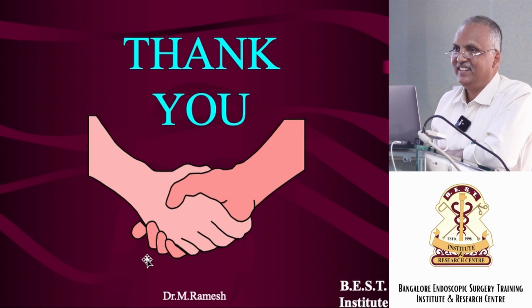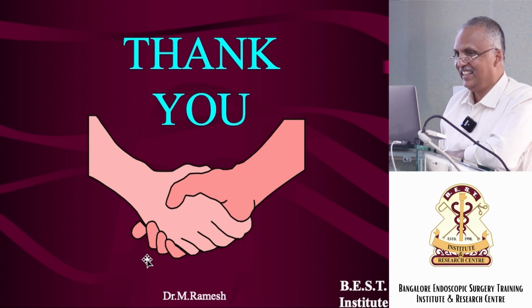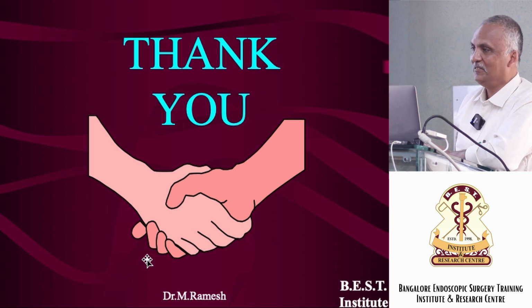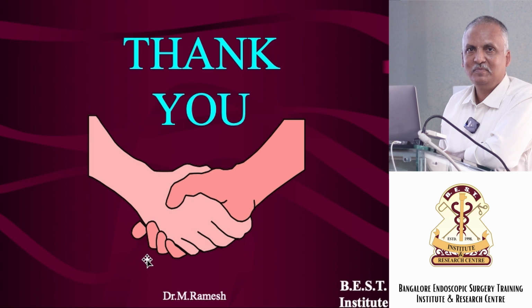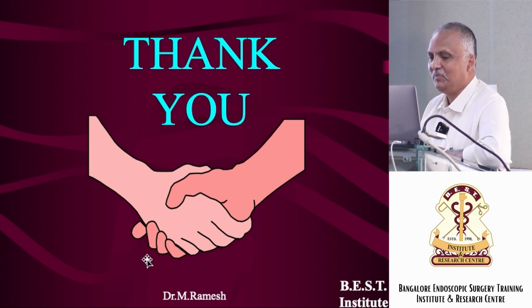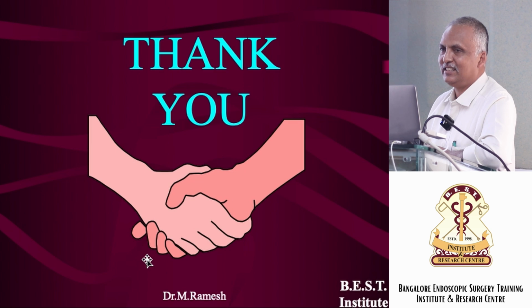So a combination of laser plus bipolar should be used. Right hand laser, left hand bipolar. That's why God has given you two hands. For retraction, your assistant will retract.